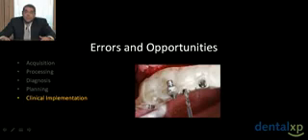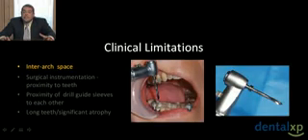With these systems, our burr systems generally start to become very long. We have the length of bone that the burr has to go in. We have the soft tissue that the burr has to pass through. We have the length of the surgical sleeve within our surgical guide that it has to pass through. So our burrs within these systems are 17, 21, 24, 28, maybe even 30 millimeters long. So we need to anticipate, can the patient open wide enough to place these burrs through these systems?